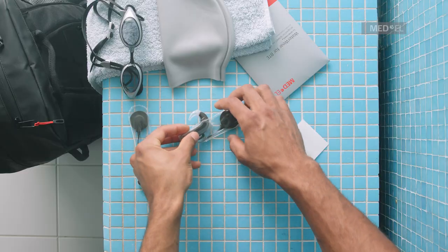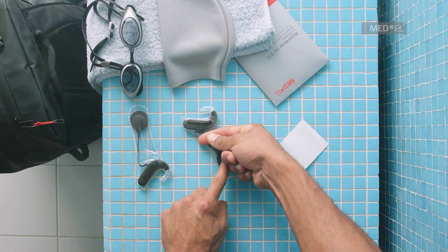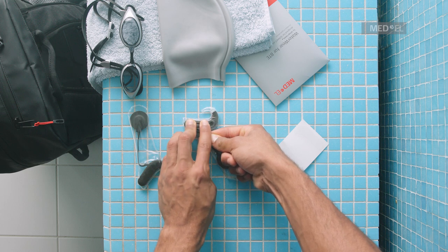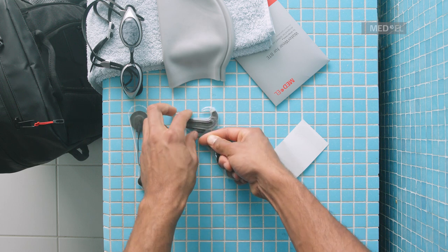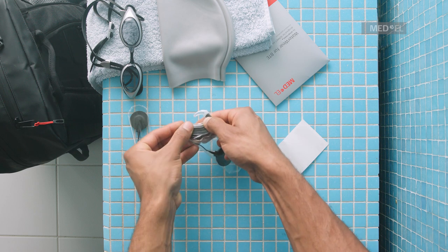Place Sonnet 2 on a flat surface. Hold onto the coil and run your fingers along the cable to press out any remaining air. Seal Waterwear completely by applying the rest of the adhesive strip. There should be no gaps between the strip and the cover.